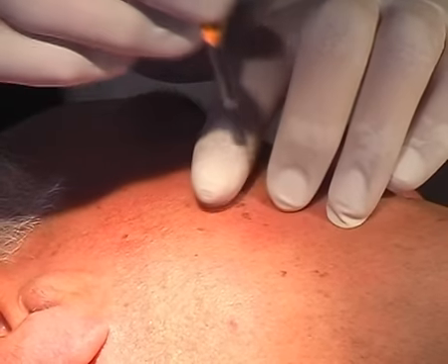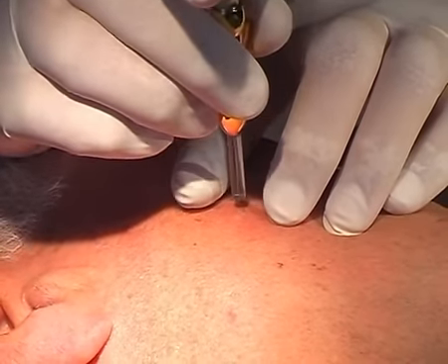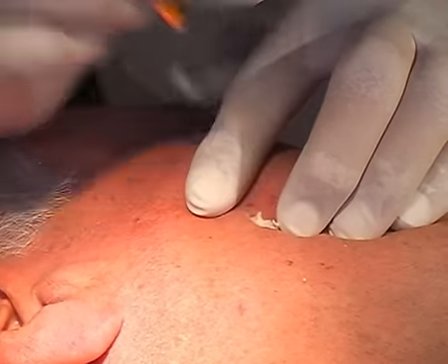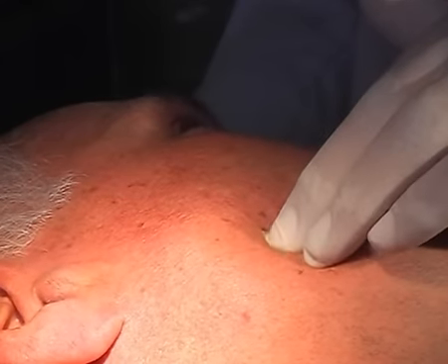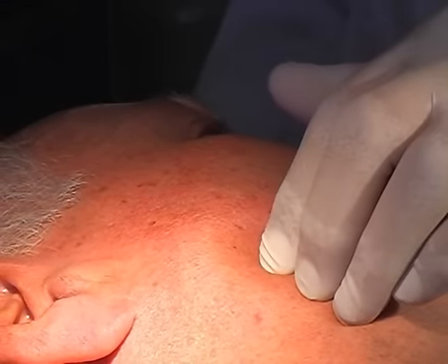The normal pigmentation will turn up again after a few weeks. On the same patient, we have another seborrheic wart. We are treating it the same way, also using a 4 mm tip. It is absolutely recommended to warm up the tissue around the treated area with the fingers. A scab will form and fall off within 10 to 14 days.